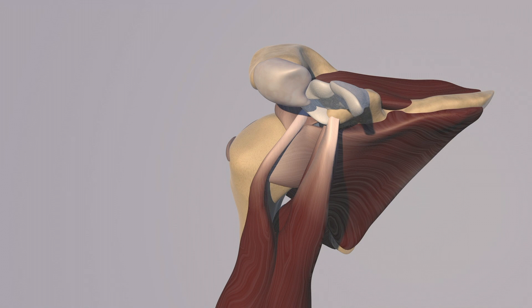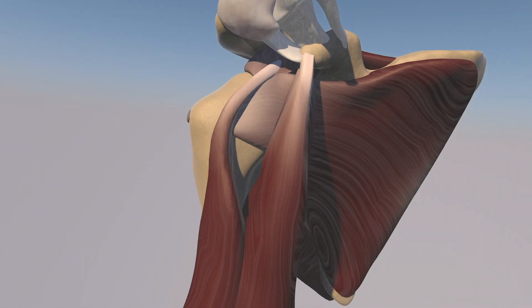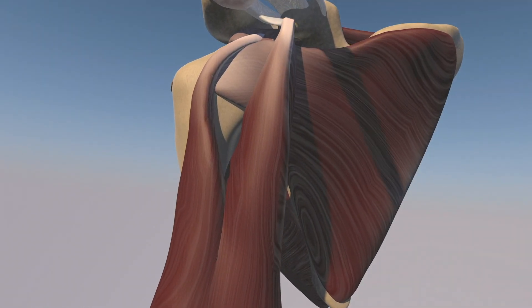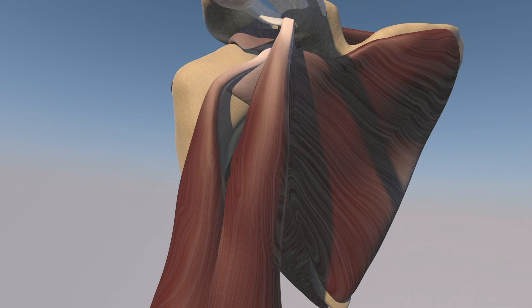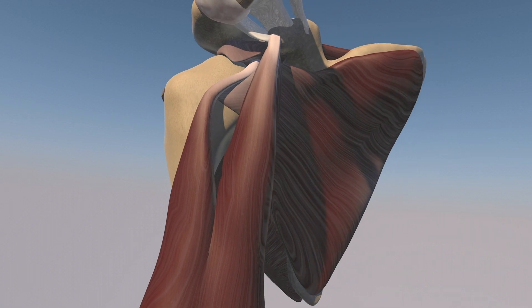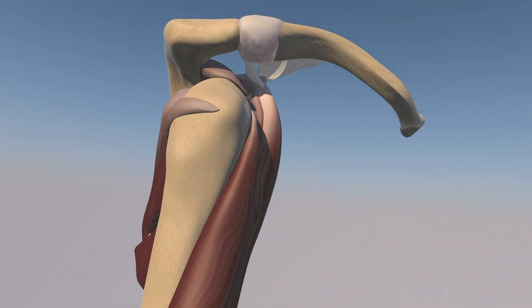He also has a complete tear of the supraspinatus tendon, which you can see here. And I believe he also has a high grade tear of the subscapularis tendon with a full thickness component as well. Therefore the biceps tendon has subluxed into this subscapularis tear, which you can see as the proximal biceps tendon subluxed medially.